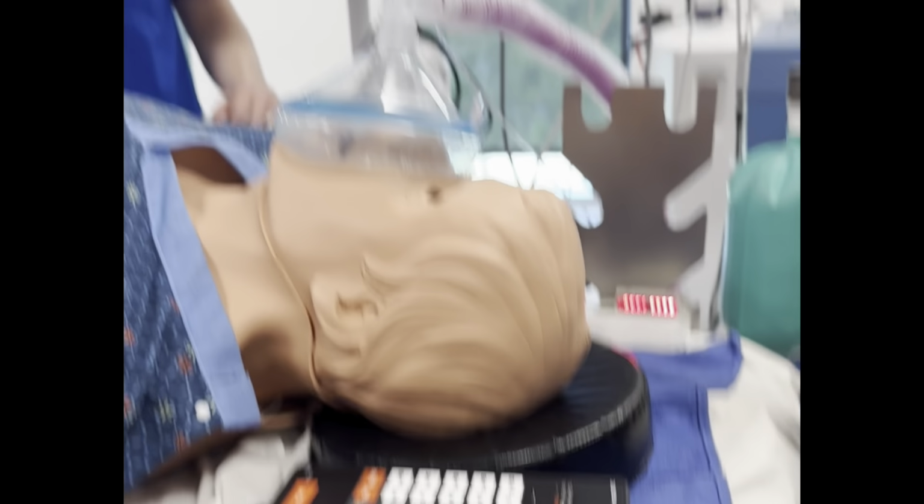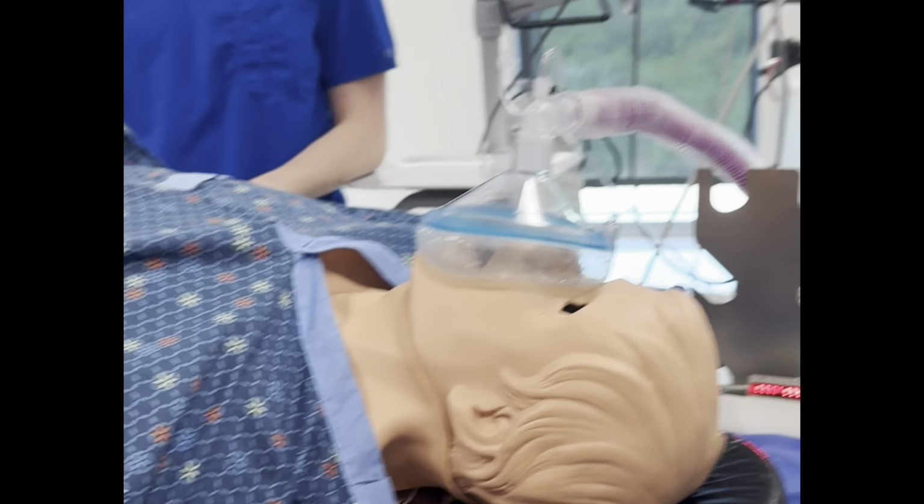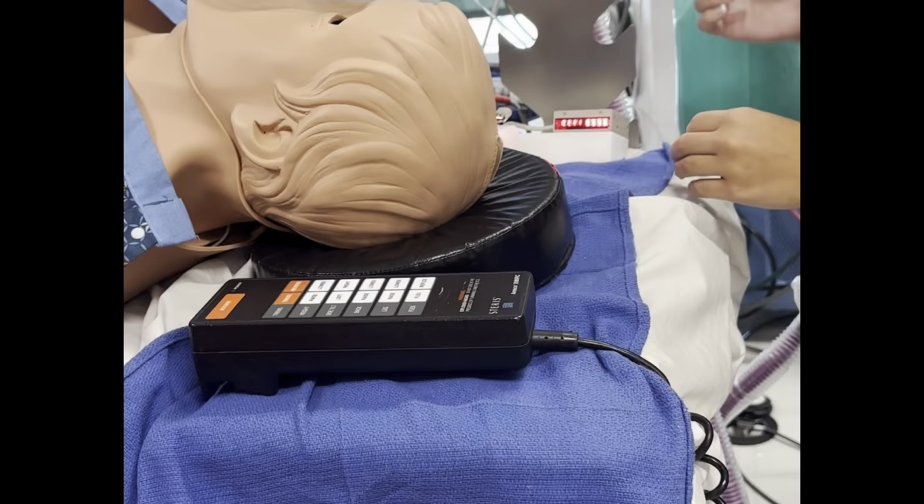have all their monitors on. So like I said, EKG, blood pressure, and pulse ox. So we're gonna start. We're gonna pre-oxygenate the patient.